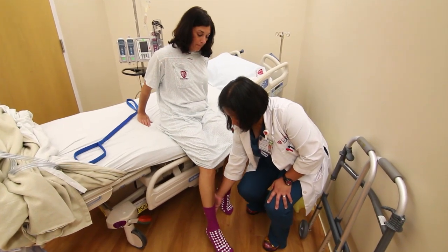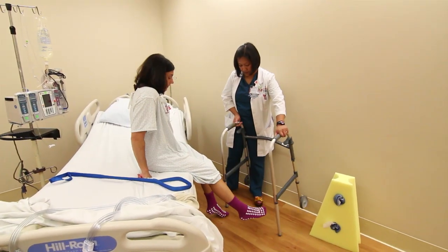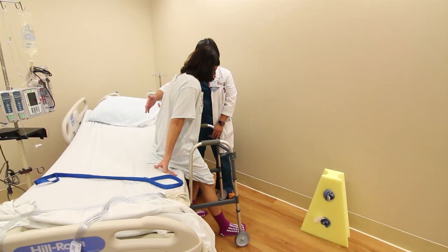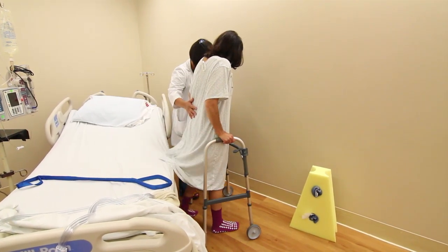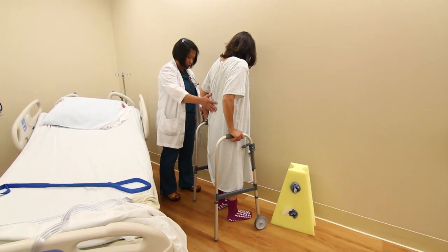Slowly move both legs over the edge of the mattress. Gradually come to a seated position with your hands behind you on the mattress to give you support. Be sure the operated foot is pointing forward. Ensure your feet are firmly planted under you, and while maintaining balance and using the walker, slowly rise to standing. Reverse the process to return to bed. A leg lifter may be a helpful tool to use for getting in and out of bed.